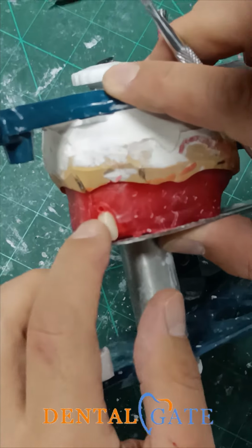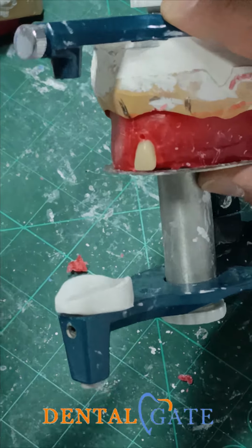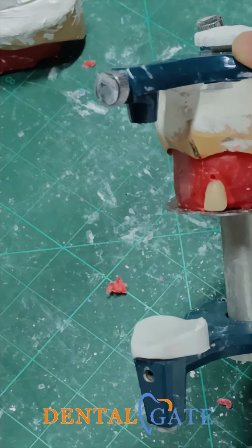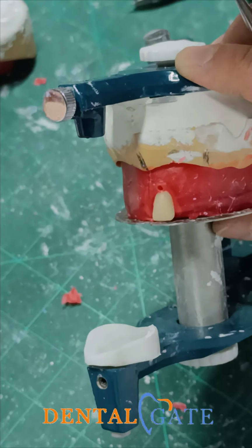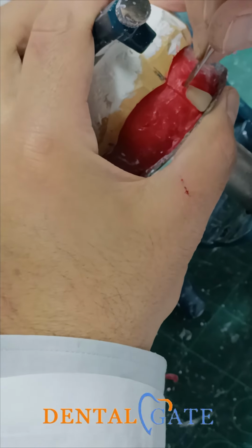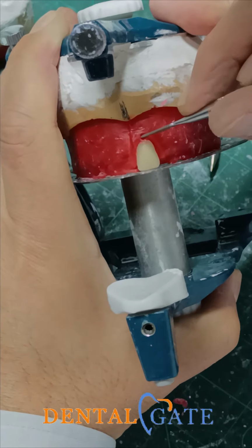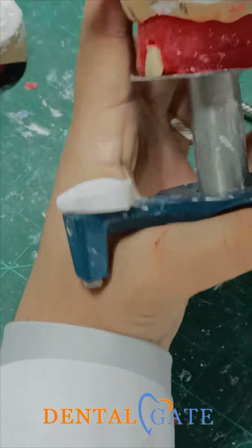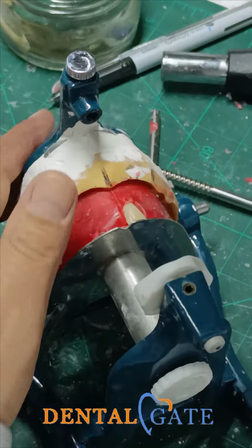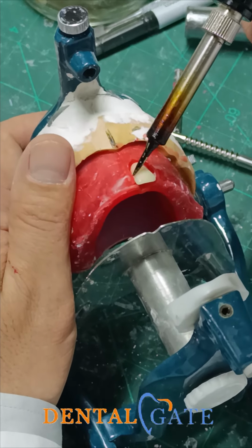Yes, you can compare it with the wax, because our wax is protruded labially to support the lip. So if I could make adjustments in the patient's mouth, I would add more wax to provide good support. This support will be transferred to the artificial teeth, okay? This is a contact now with the table. Now this is proclination toward the labial, and now make a seal to provide a final seal.